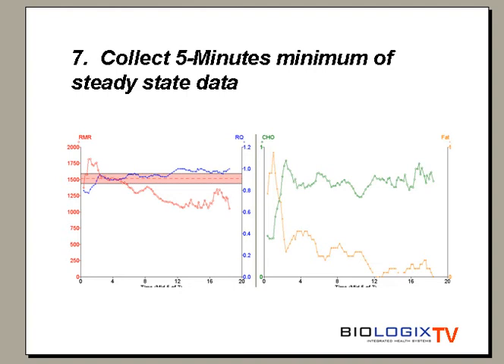So what is steady state? Well, it's when you see that red RMR line flattening out horizontally. If it is still scattered at the 7-minute mark, leave the room and return later.